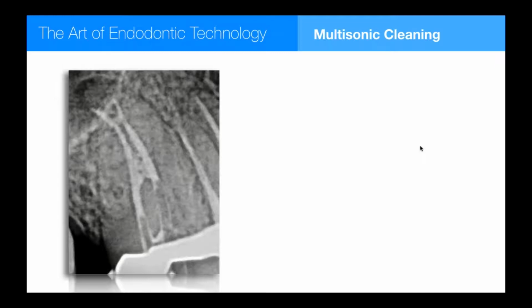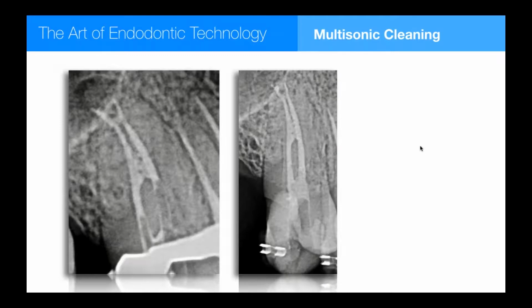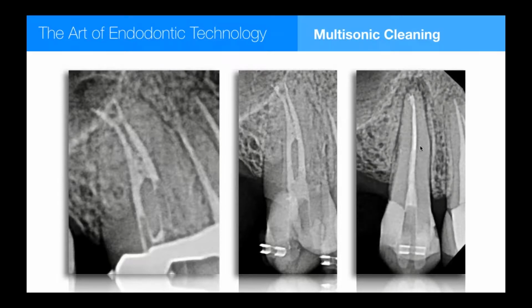And here's the down pack film. You can see these are super small shapes. I used a 3D shaper file from Brasseler. Literally, it's like putting a spring in a root canal, so it enlarges to cut the root canal from its natural form to some slightly larger size. So I love using those with Sonendo because Sonendo cleans without you needing to cut a shape. This cuts a shape that's minimal and usually provides me with a nice enough path to fit a cone and make obturation easy. But look how diminutive, how utterly conservative this looks from the straight buccal approach.